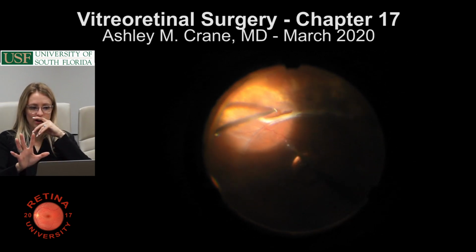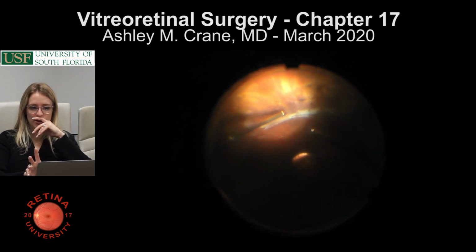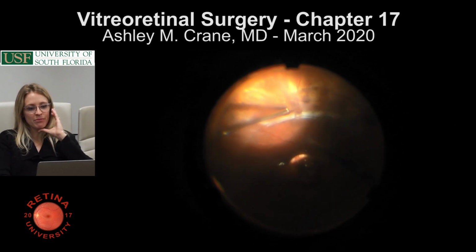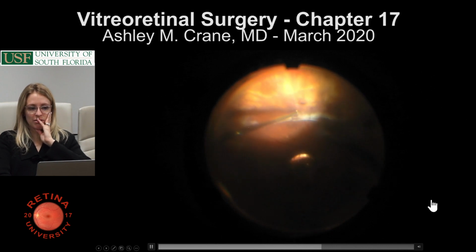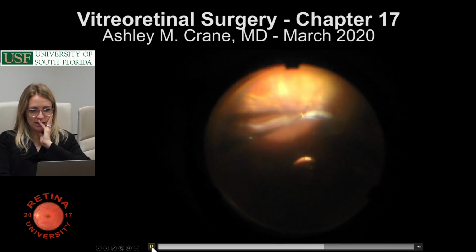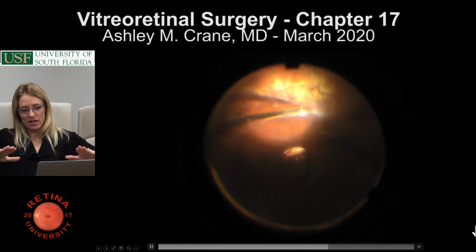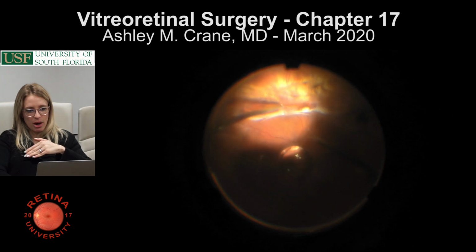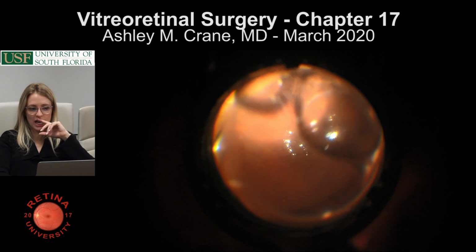So these are several of the steps that maybe you've heard of but never seen and don't quite understand when you see it in the notes, right? So membrane peel and retinectomy. Okay, so that's basically releasing the retina, and then we're going to probably fill up more with PFO, and then we're going to go to air.